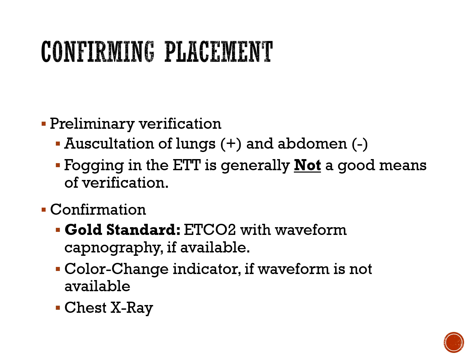Fogging in the endotracheal tube is generally not a good means of verification. It's been studied. This is not anecdotal. There are actually a couple of published papers out there. They talk about what are good indicators, what are not. Again, fogging, if you choose to use it along with a montage of other things, which include auscultation and end tidal, fine. But don't use it as a sole means.